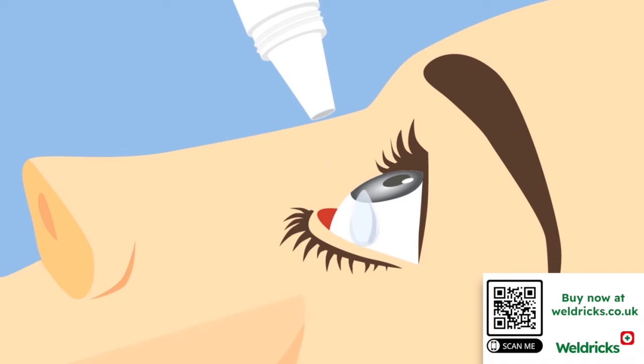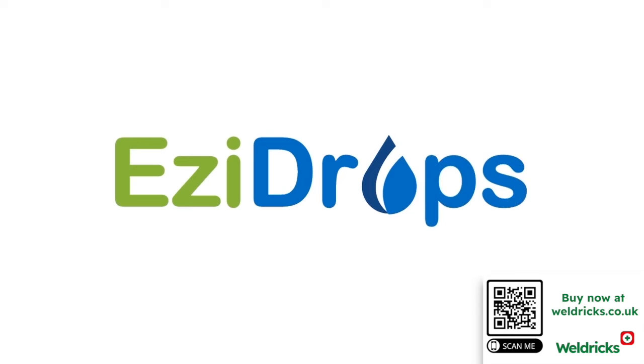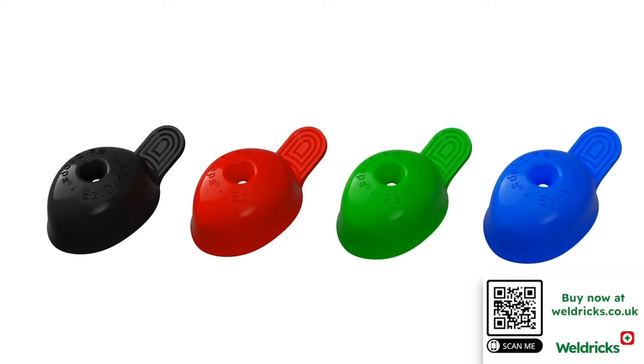Struggling putting your eye drops into your eyes? Always finding that the drops never drop directly into the eye and you keep missing? Frustrated? We have the perfect solution: Easy Drops.